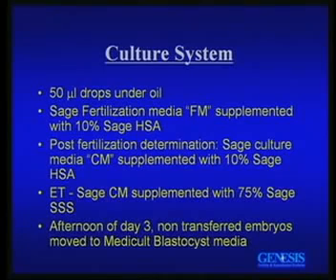In terms of the culture system, everything is cultured in 50 microliter drops under oil. I use Sage fertilization media, supplemented with 10% HSA. Post-fertilization, again, Sage CM, supplemented with 10% HSA. And for day 3 embryo transfers, the media is supplemented with 75% SSS.